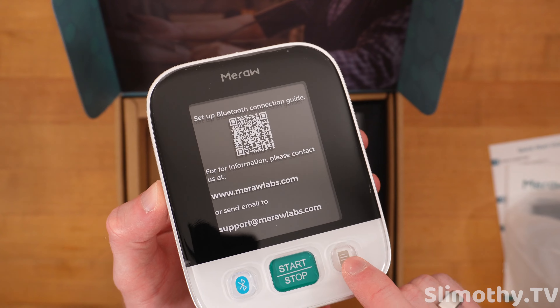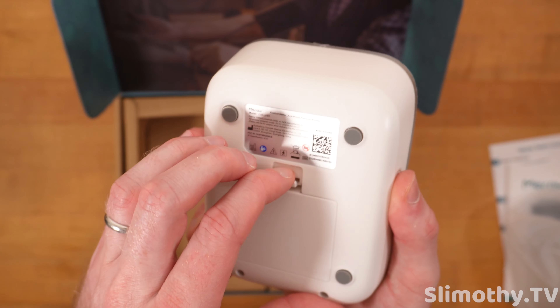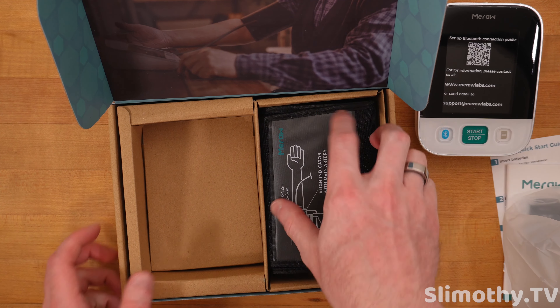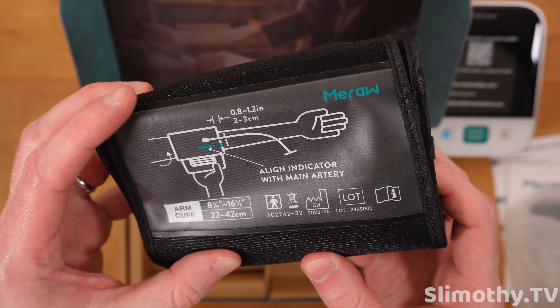It looks like we've got a Bluetooth button, start/stop, and a menu button. On the back, this is where you put the batteries, and it has little feet so it doesn't roll around when you place it down. And here is the armband.